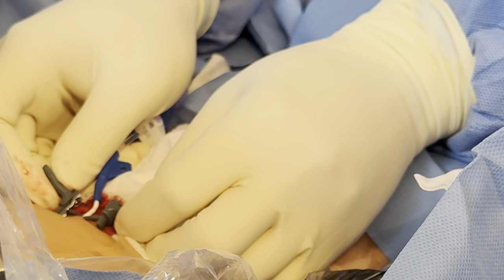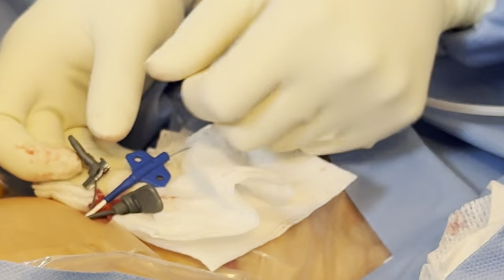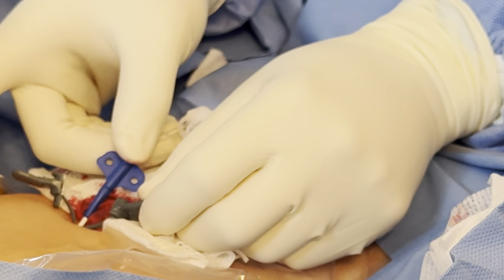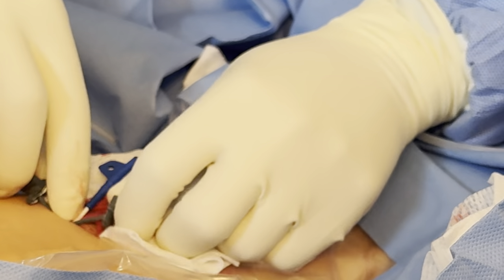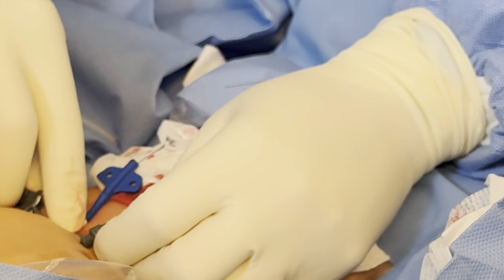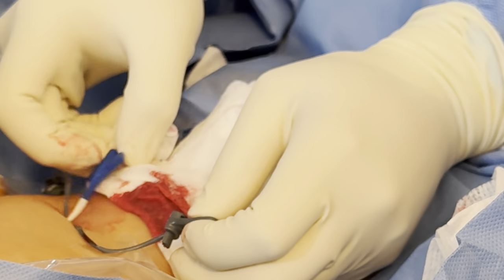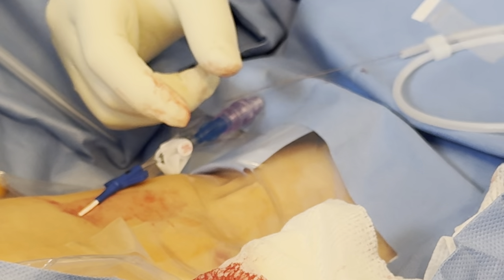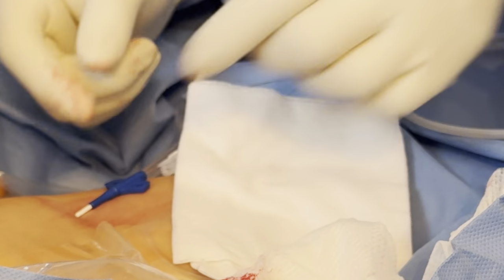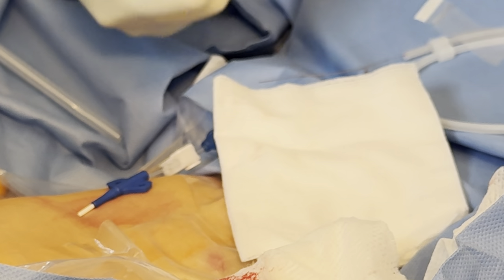This is an 11 cm catheter vein purchase — however, this is a 7 cm dilator. So I need to be careful not to lose vein purchase because of careless sheath removal. These catheters are all tapered, but this one in particular stops at about two centimeters. I need to break it now — that's three centimeters exposed. So I want to push that back in while it's broken to make sure I'm not losing access to the vein. I'm going to apply tension, continuing to push the catheter in while pulling this out. You can also put pressure with your index finger at the insertion site to keep the catheter from coming out, then split the sheath at the skin.